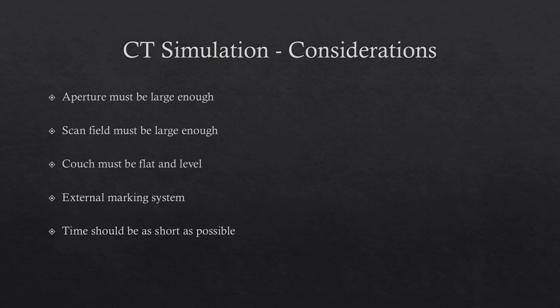Here is a part of the CT simulation considerations for the week 14 lectures. The CT simulation considerations include: aperture must be large enough, scan field must be large enough, couch must be flat and level, external marking system, and time should be as short as possible. I'm going to explain why for each one.